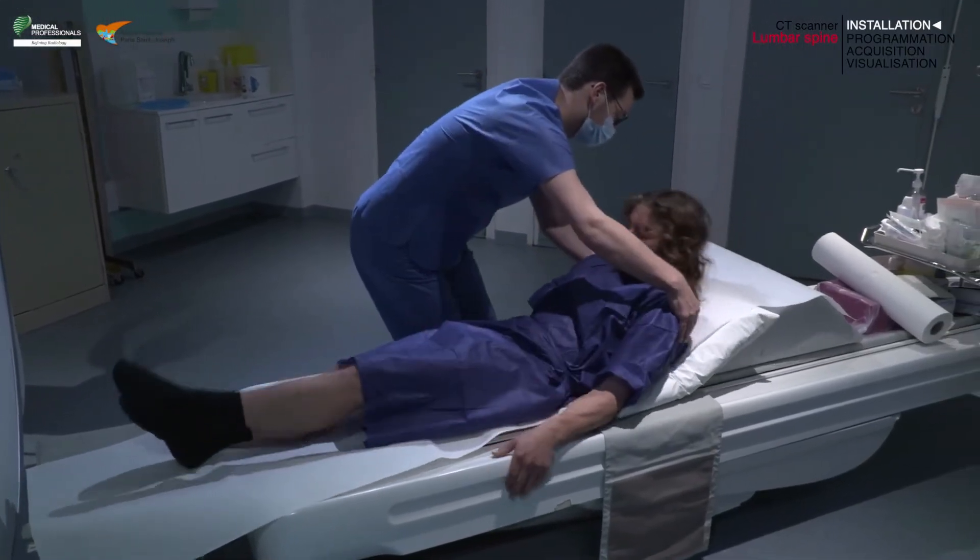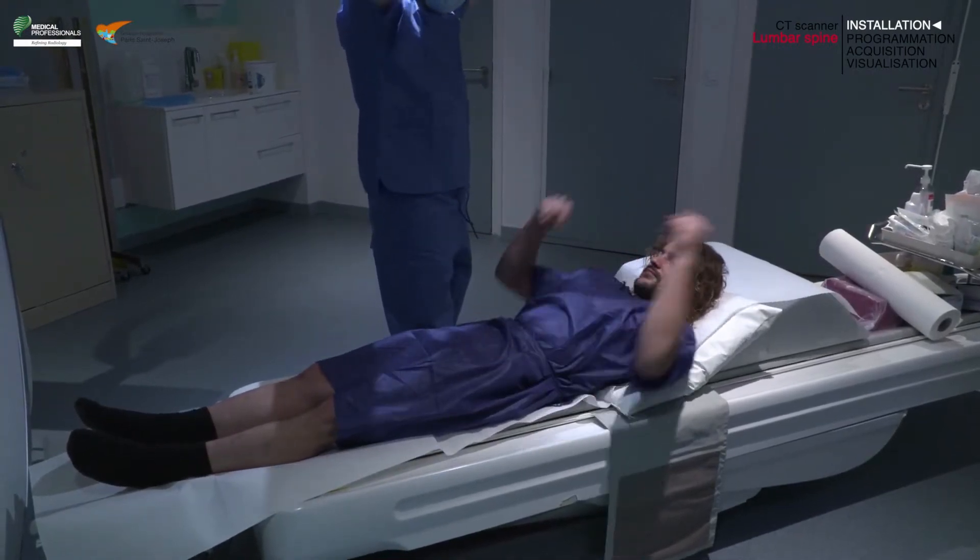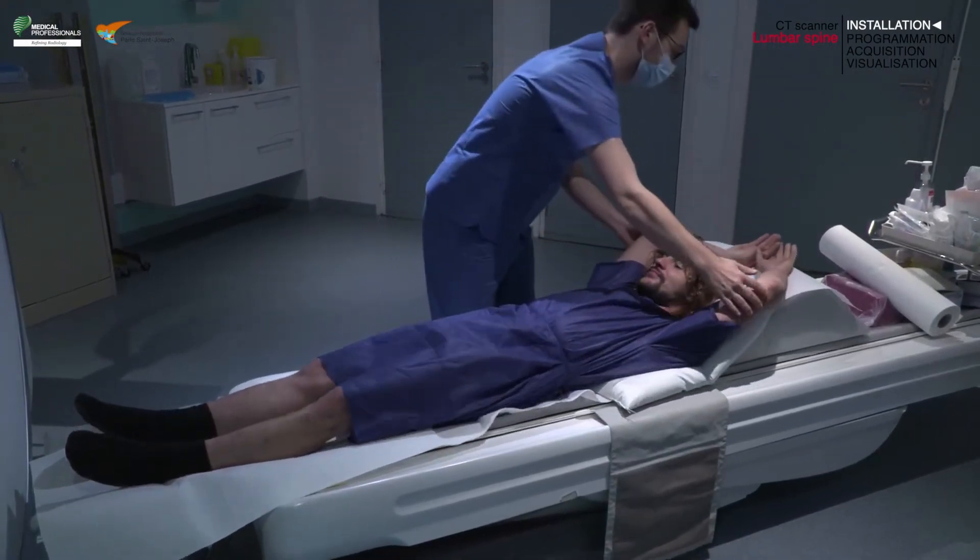For the patient's comfort, place a pillow or inclined plane under the patient's head. You can also place leg elevation pillows under the patient's knees.